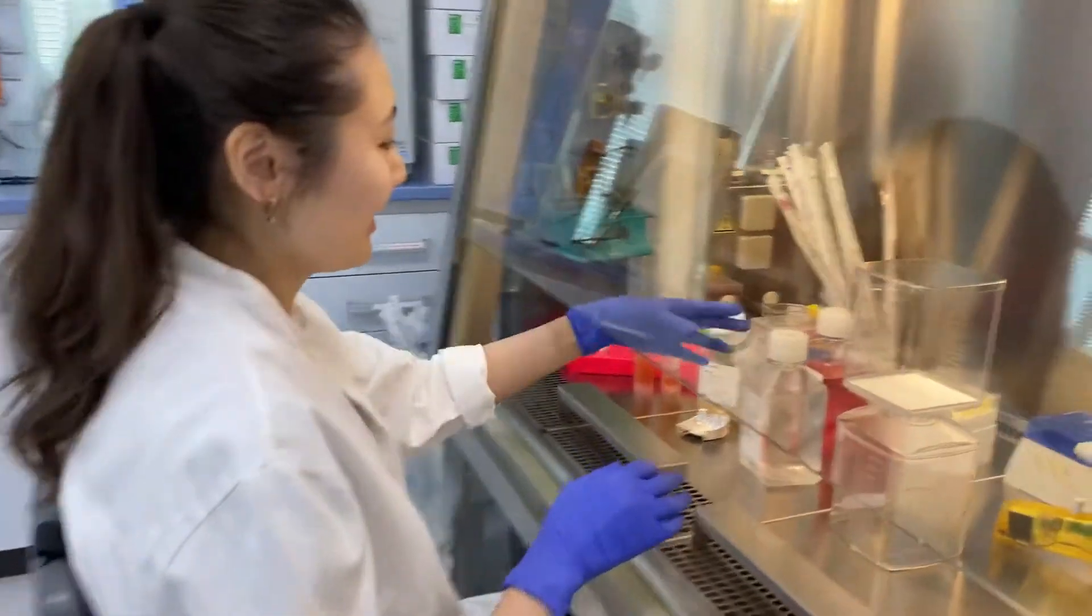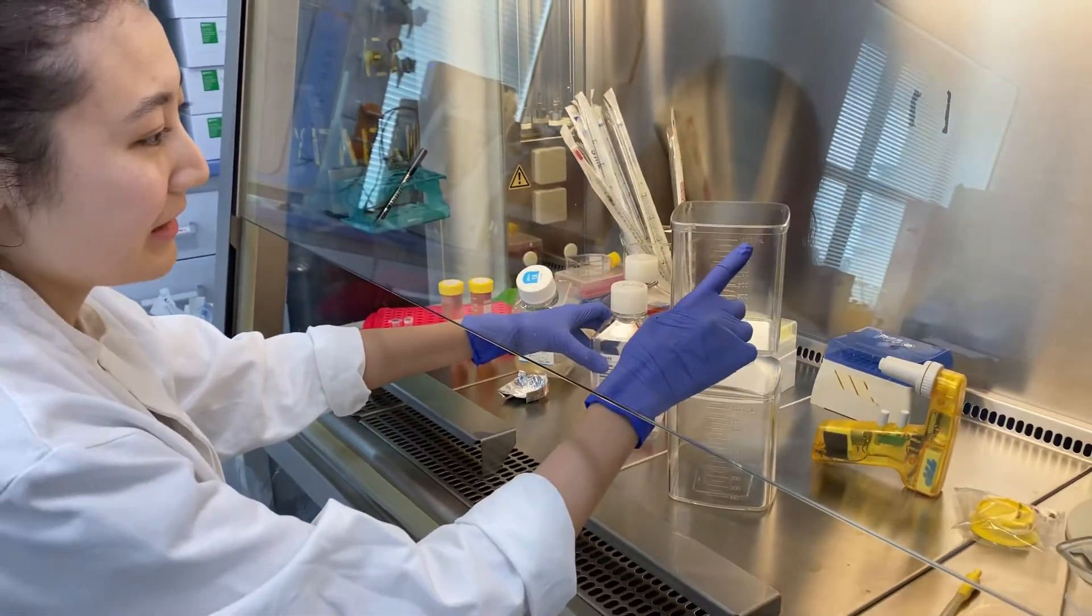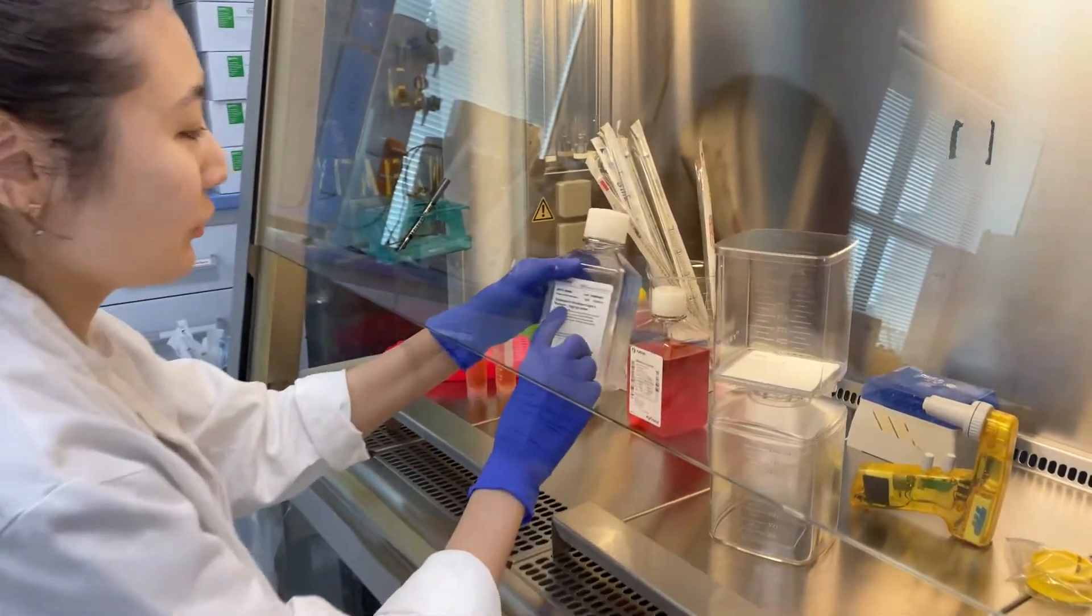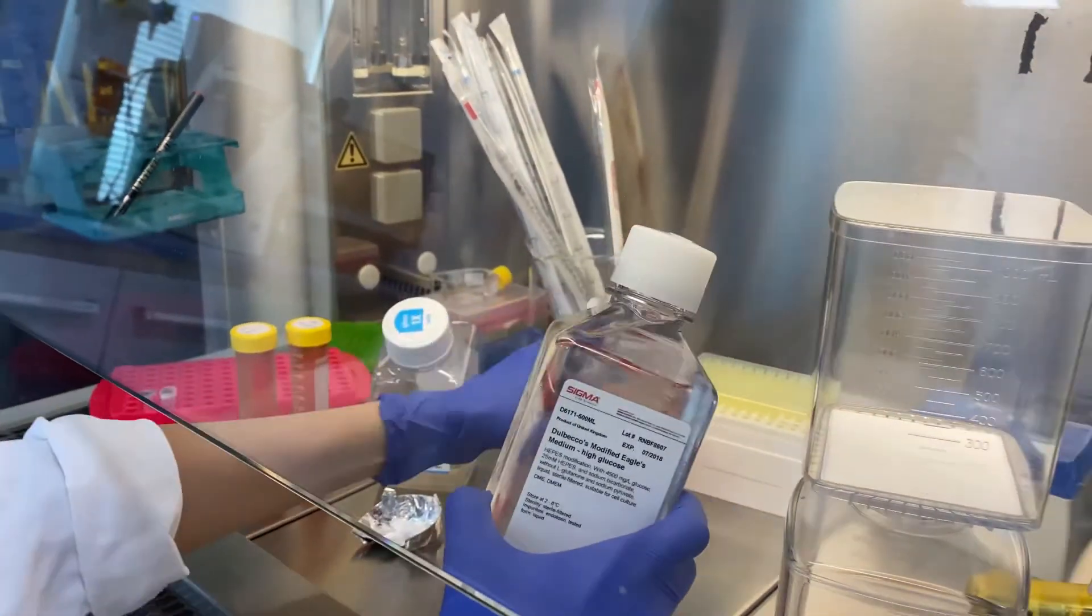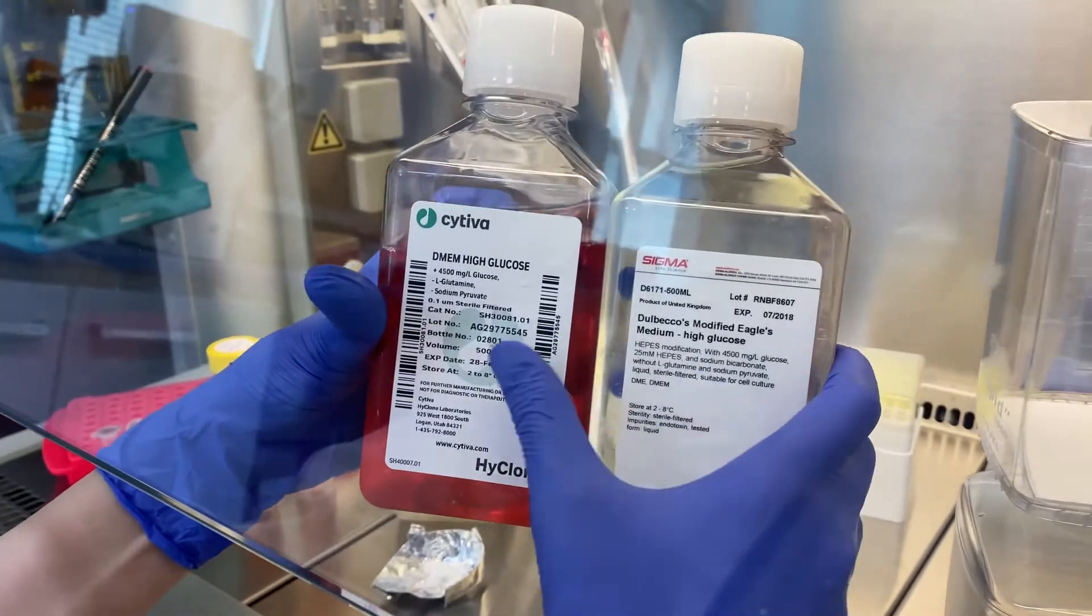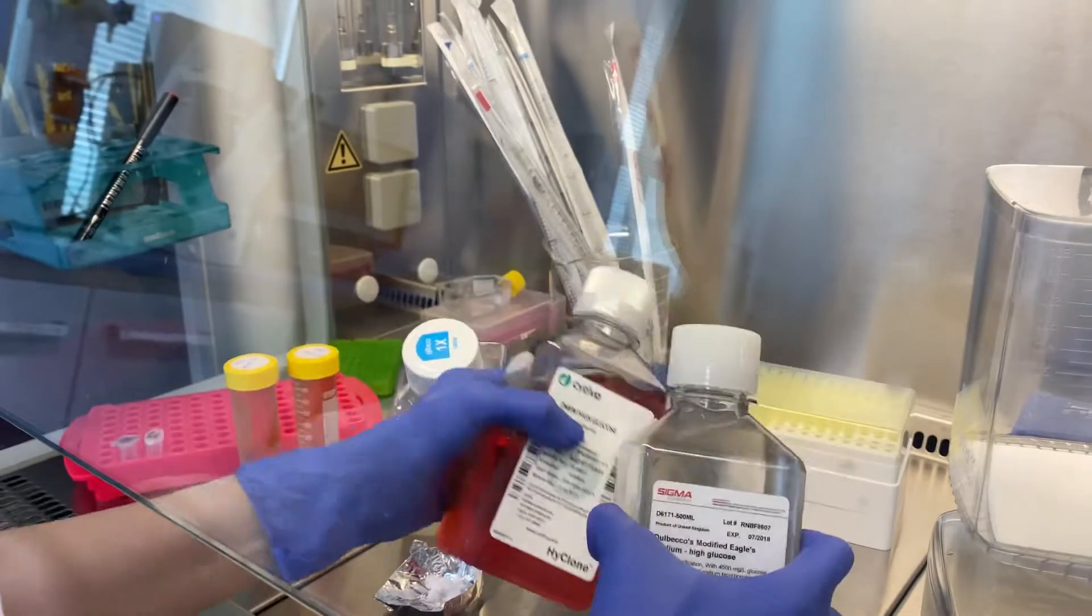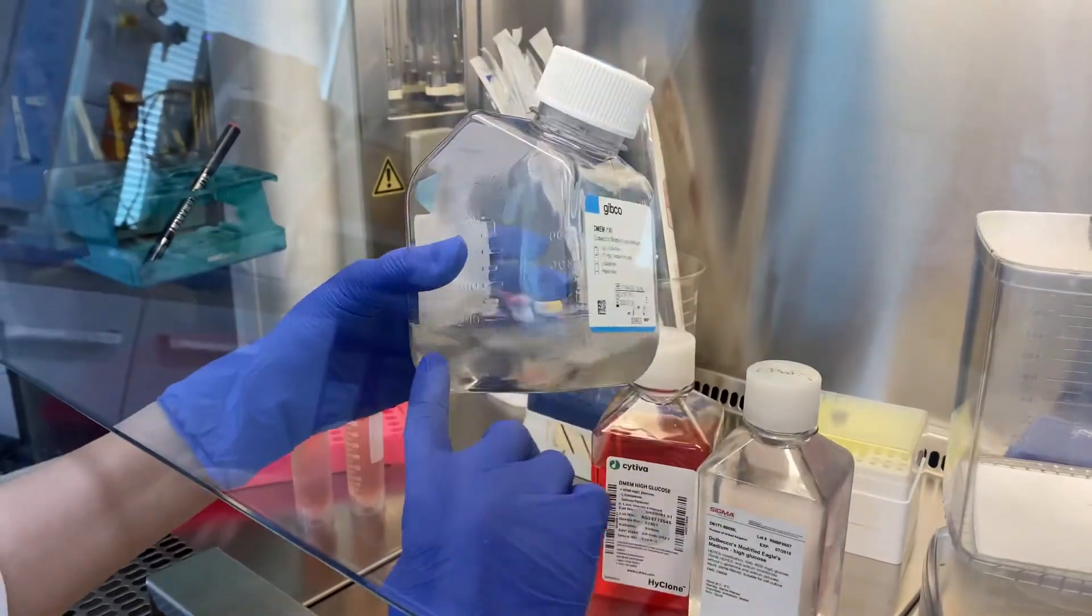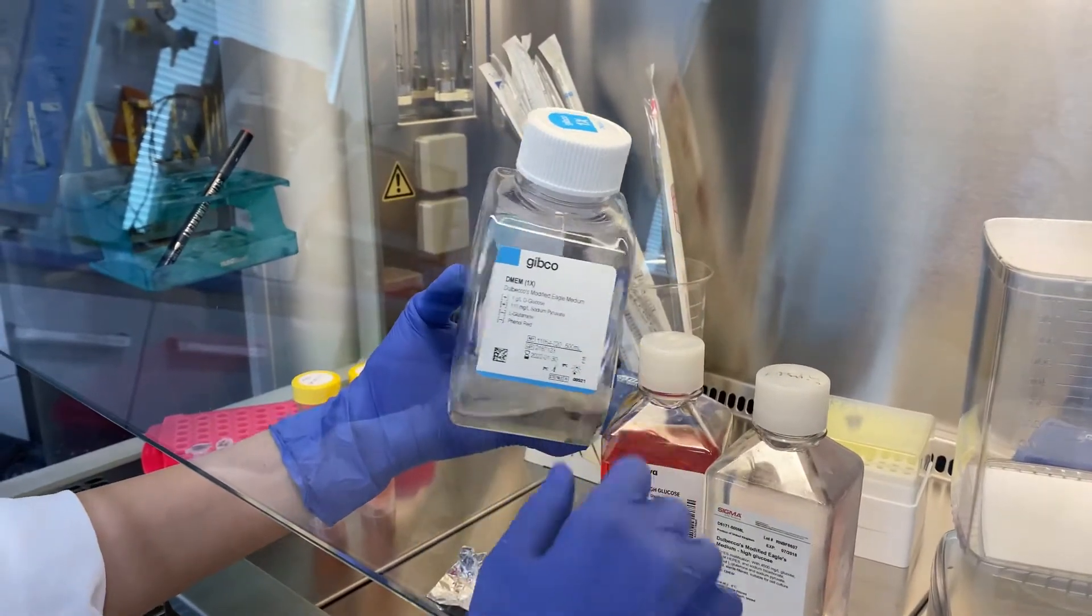First of all, we will make 1000ml of DMEM. We need Dulbecco's Modified Eagle's Medium High Glucose like this. These things are absolutely the same but from different companies. So I will use this one. Also I have a little bit of this DMEM, Dulbecco's Modified Eagle's Medium.